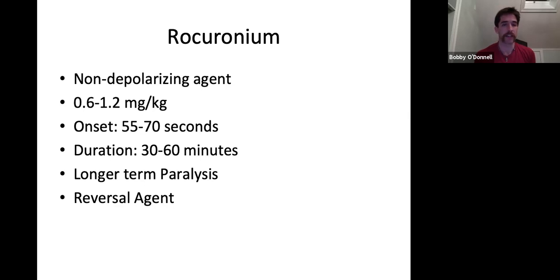If we have a patient that's non-compliant to the vent and you're more maxed out on your pain management, when we think of reasons that patient would be non-vent compliant: are the settings off? Are they not sedated enough? Are they hypotensive, so their sedation is kind of maxed out as well?